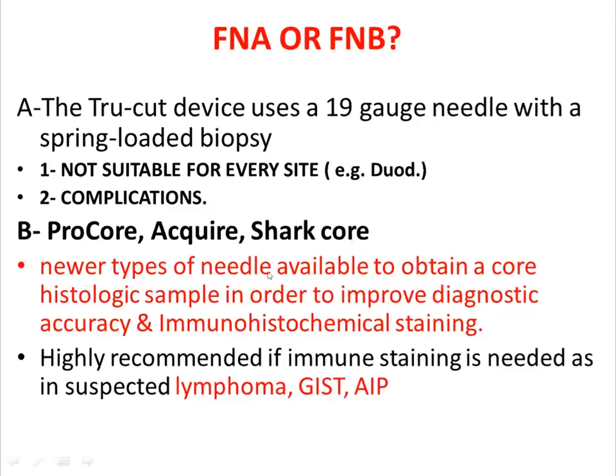These are newer types of needle available to obtain a core histologic sample in order to improve diagnostic accuracy and important for immunochemical staining. Then what to use, FNA or FNB?